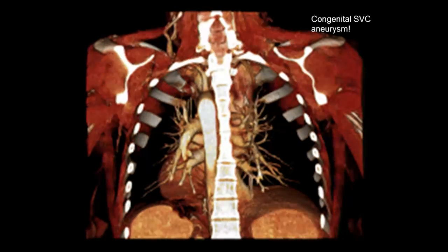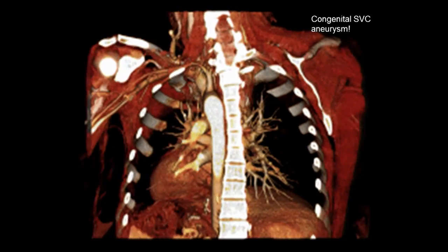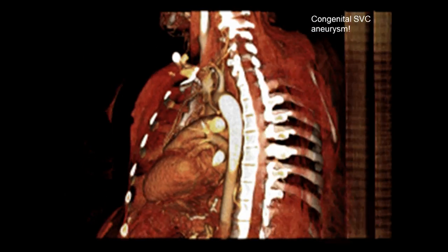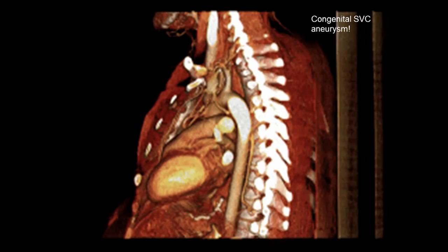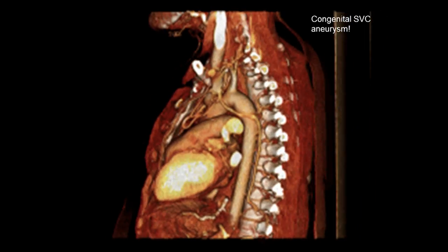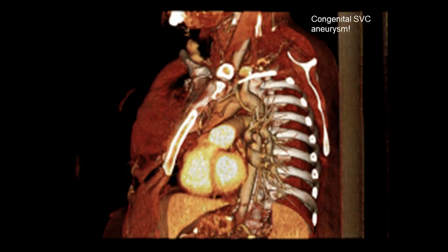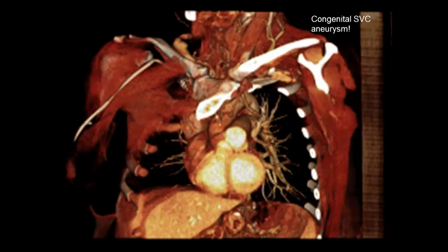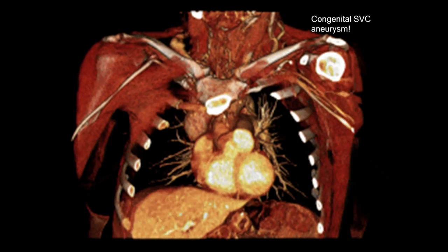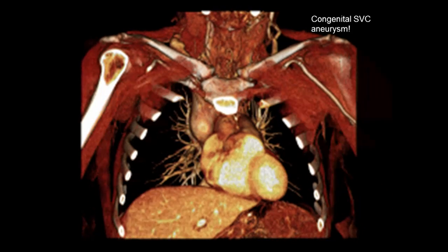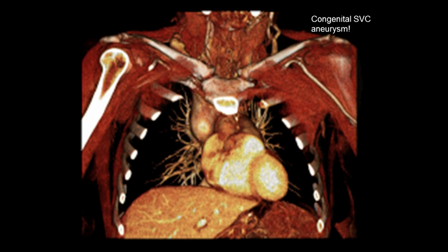We're rotating around and looking from the back. We see the descending thoracic aorta. Now we can see the left ventricle and the pulmonary arteries. We come back to the front, and there's our big SVC, right where it's supposed to be.